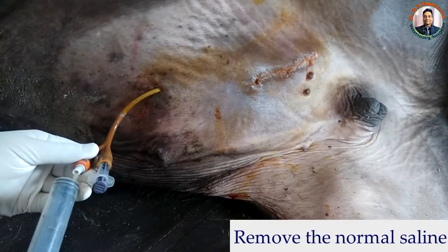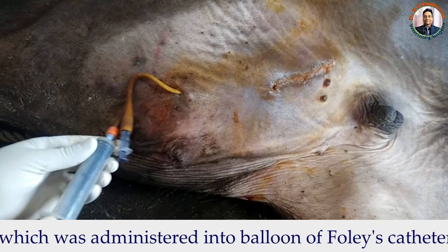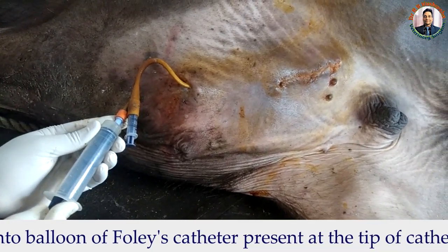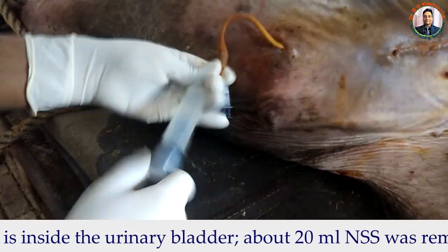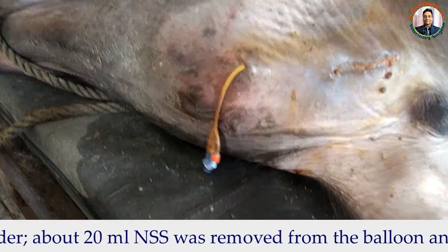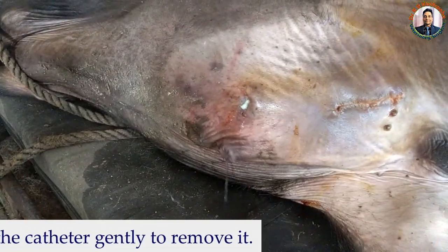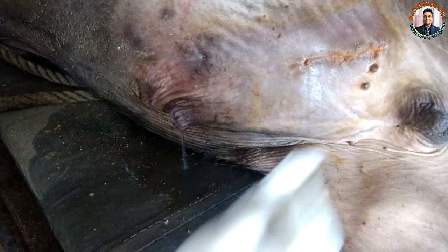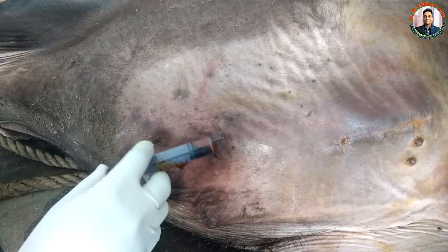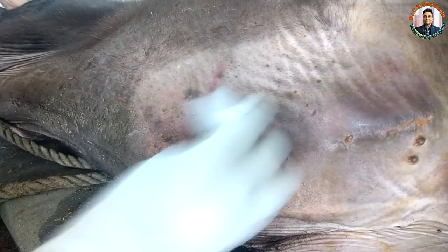For removal of the Foley catheter, we first remove the normal saline solution from the balloon. We take a 20 ml syringe, attach it, and remove approximately 20 ml of normal saline solution. After this, we gently pull the Foley catheter — as you can see, it comes out easily from the tunnel. Once the Foley catheter is outside, we clean the tunnel and infuse four to five ml of Betadine solution into the tunnel.